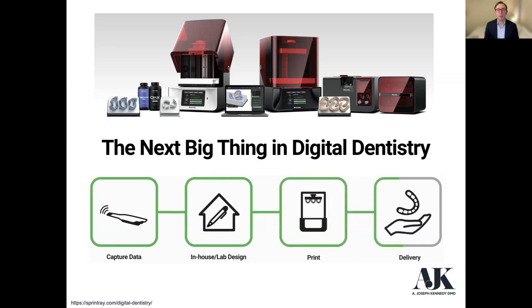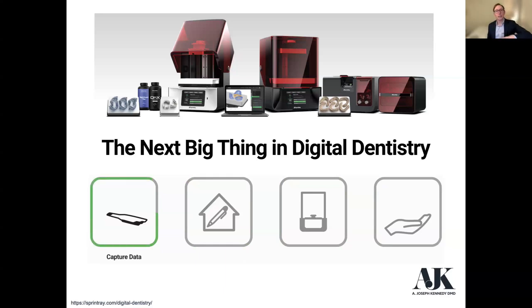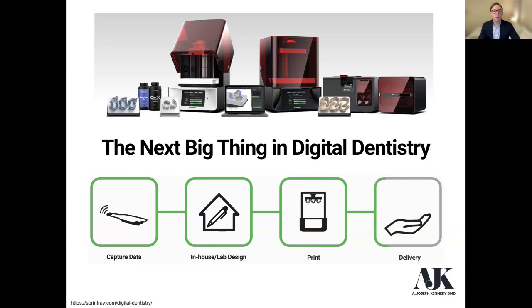The nice thing, and I think a lot of people have gotten into this, is because this is pretty cost effective. Many of us have a digital scanner already. These units are anywhere between $7,500 to as much as $60,000 or $70,000 if you want a full, like, floor to ceiling carbon lab type printer. But it depends on what you're trying to print in your office and what the needs are of your practice. So again, we can scan, we capture the data, we take it to our in-house, or we send it to the lab and the lab designs it. We print it in our office, or the lab is going to be printing it in the lab, like NDX, and then we deliver it to our patients.